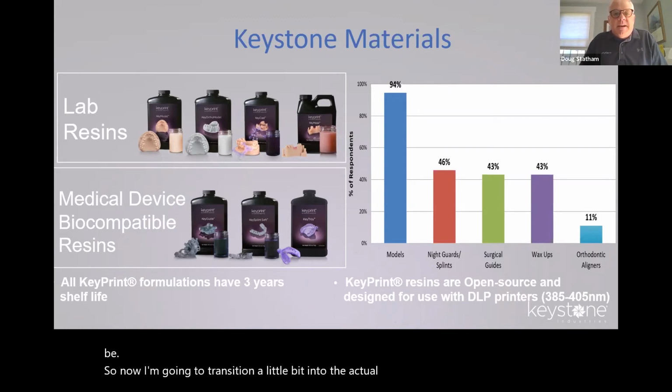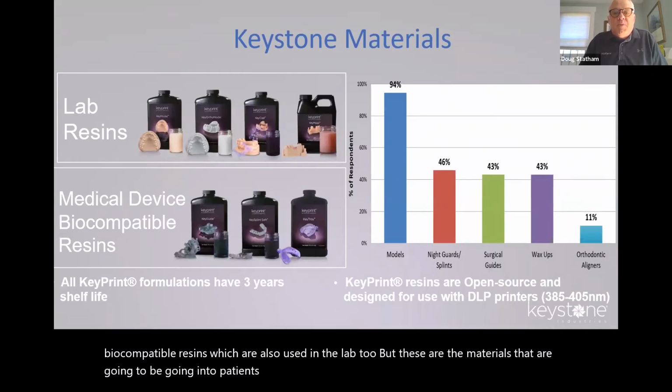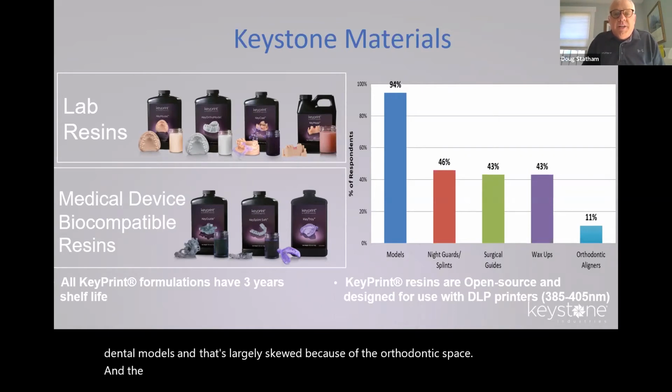I think there's going to be a lot of opportunity for design of these surgical guides. Some of these doctors may choose to do them in office, and there's a great opportunity for you folks to partner with your doctors. We saw this with the milling. A lot of these doctors got involved with CEREC thinking they were going to save all this money from the laboratories, but quite frankly, they're just doing single units. That is such a competitive market. There's not a lot of margin in it. If you partner with these folks and say, yeah, we understand, a lot of times these doctors are going to end up sending over their harder cases, which is really where there's better margins.